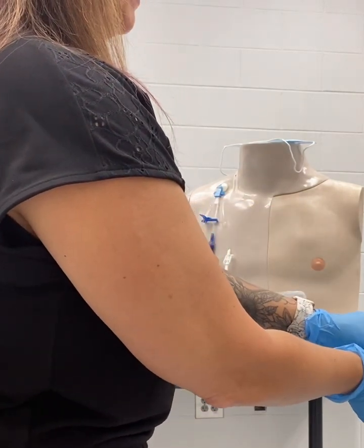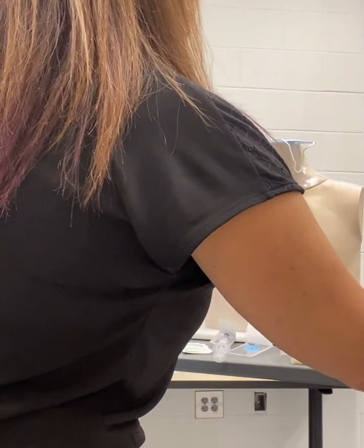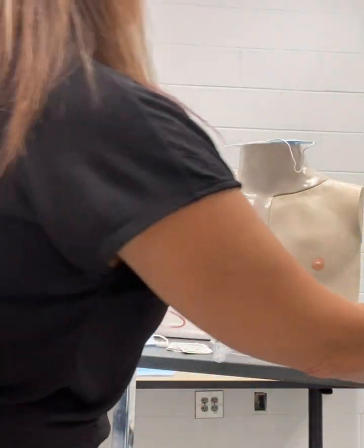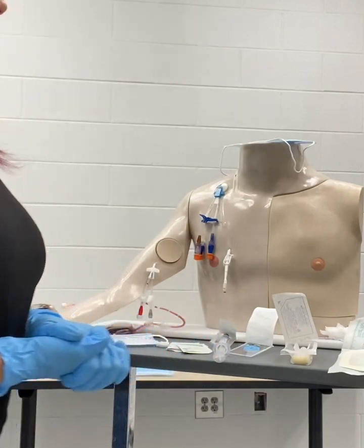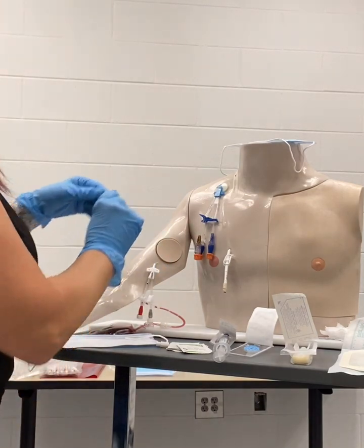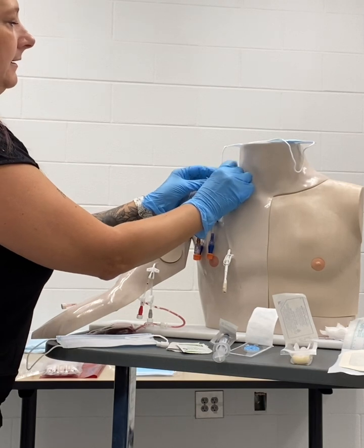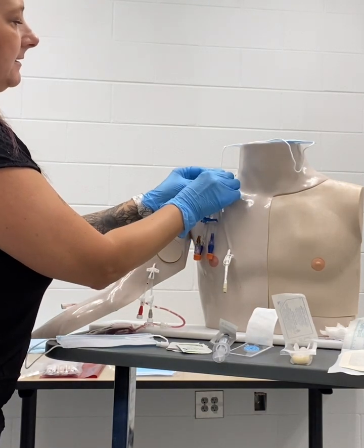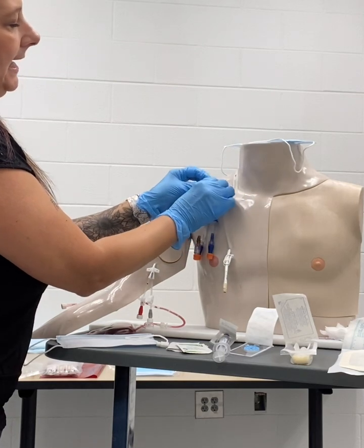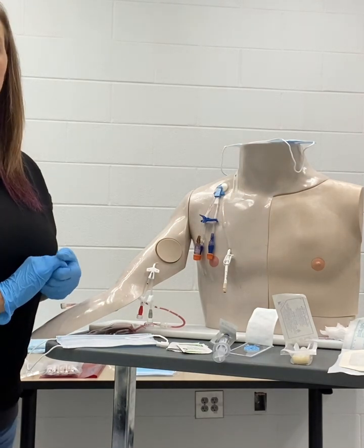I'll need a new tegaderm and will open that away from me as well. And then I will need three alcohol-infused caps to put on the end during the procedure. With my clean gloves on, I'm going to go ahead and remove the patient's old dressing. We will pull the tegaderm off inward towards the patient's side, and then slowly remove that and discard. We will discard our gloves and cleanse our hands.